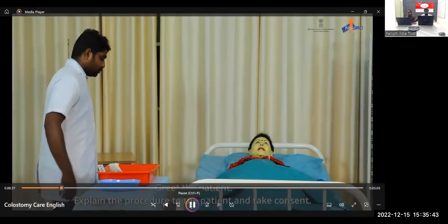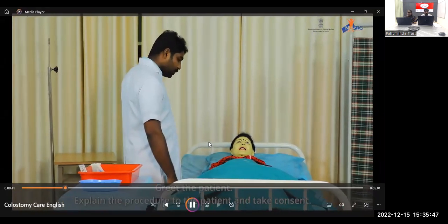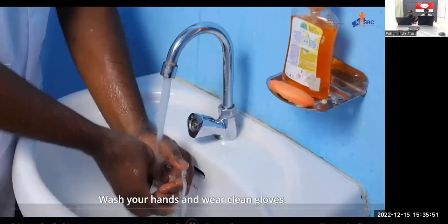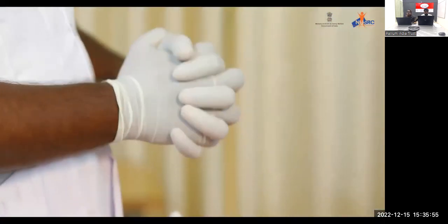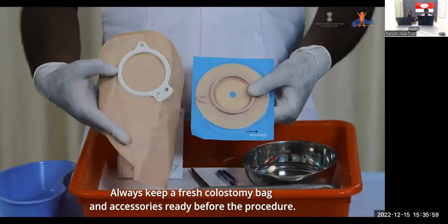Procedure: greet the patient, explain the procedure to the patient and take consent. Provide privacy. Wash your hands and wear clean gloves. Always keep a fresh colostomy bag and accessories ready before the procedure.